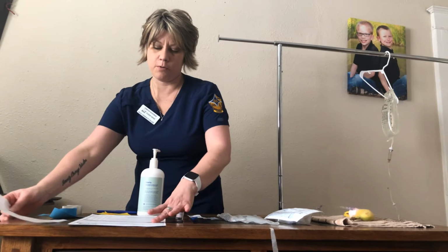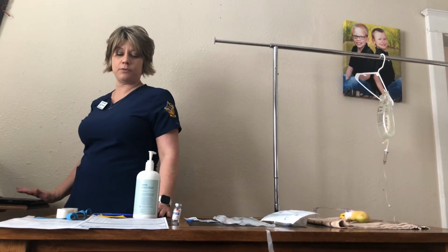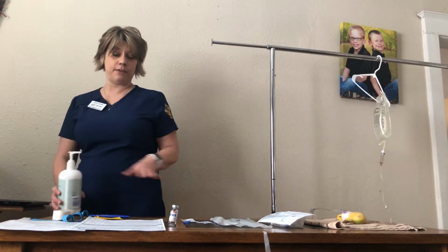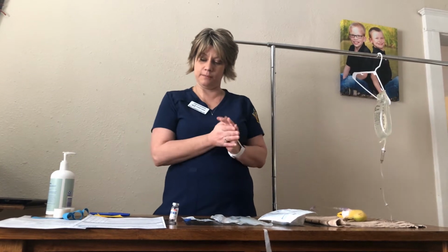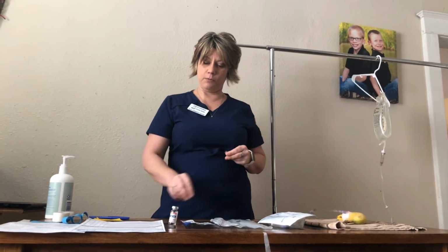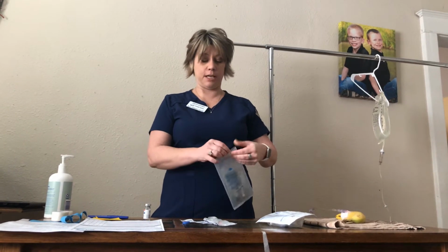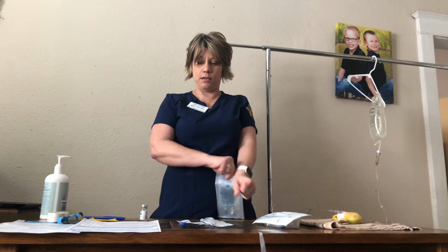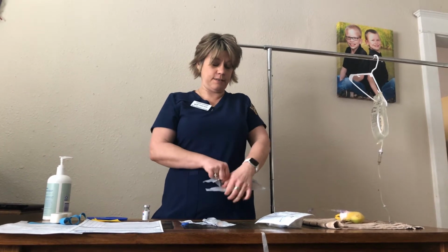Okay, so now that I've confirmed the MAR, verifying the patient, the med, dose, route, and time, and at the bedside I've checked the patient's 2 identifiers, we are going to go ahead and get this started. I'm going to perform hand hygiene again, and we are going to be adding from our medication vial our antibiotic into our piggyback saline.